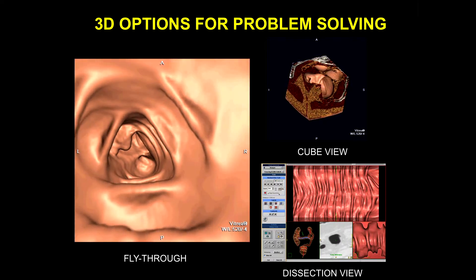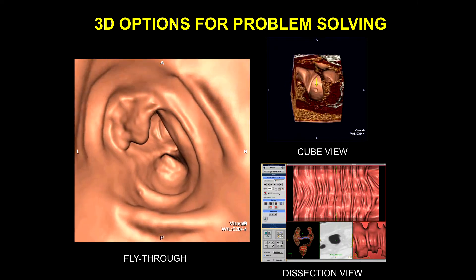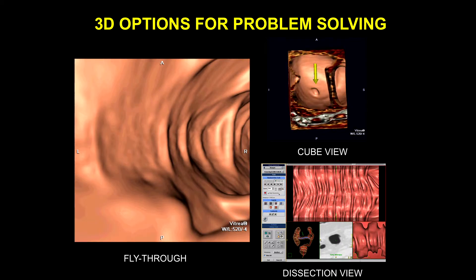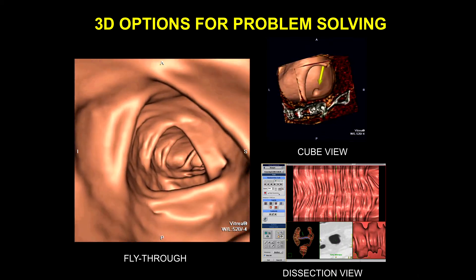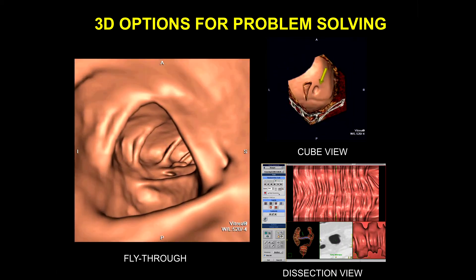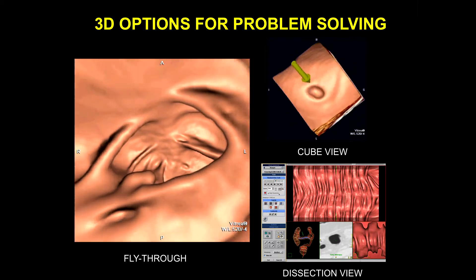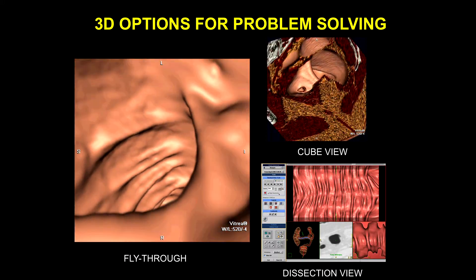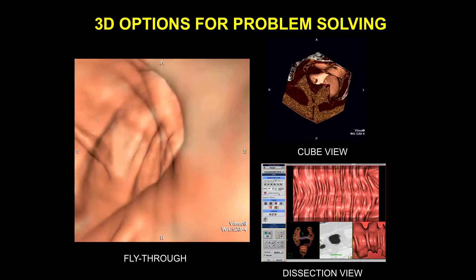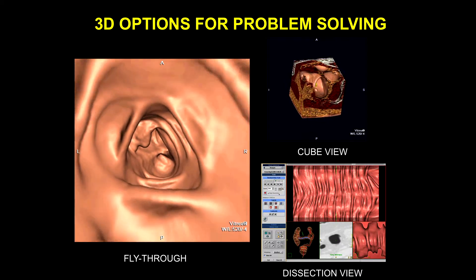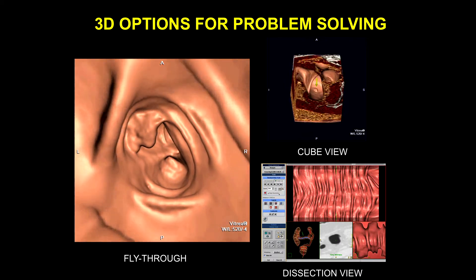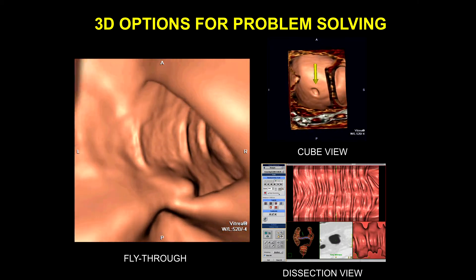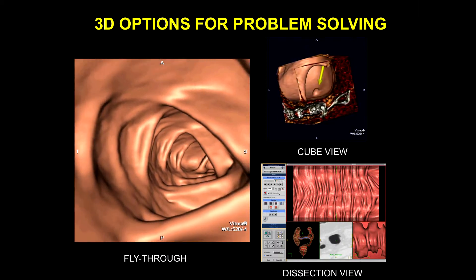The various options on your 3D include your traditional fly-through. This is a carcinoma that we're just flying by, and then multiple polyps beyond that. You have your sub-volume cube view, which you can rotate 360 degrees — it's a nice way to easily problem-solve lesions. And then one of the more novel views is your dissection view, which I'll talk a bit more about later.